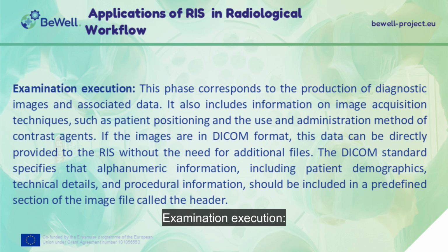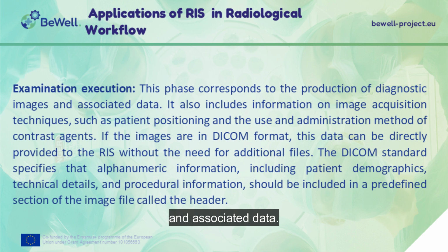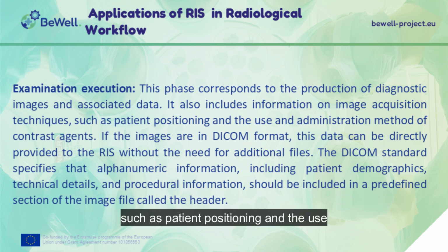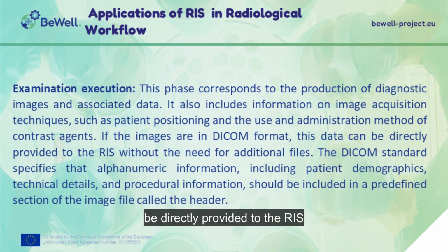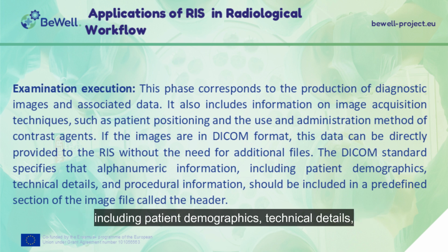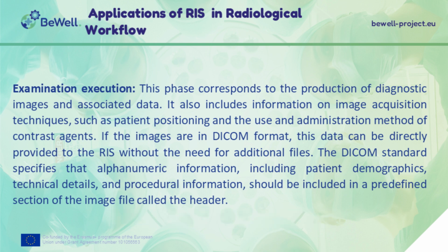Examination execution. This phase corresponds to the production of diagnostic images and associated data. It also includes information on image acquisition techniques, such as patient positioning and the use and administration method of contrast agents. If the images are in DICOM format, this data can be directly provided to the RIS without the need for additional files. The DICOM standard specifies that alphanumeric information, including patient demographics, technical details, and procedural information, should be included in a predefined section of the image file called the header.